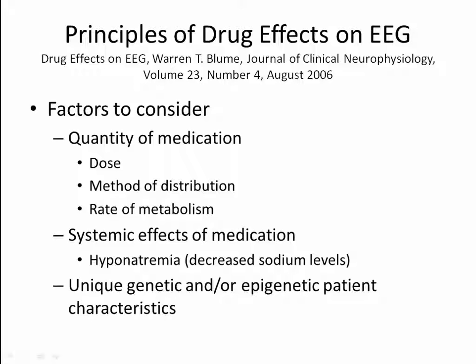And that's fine, but it suggests that the effect that medication has on one person may not be the effect that it has on another person. So coming up with standardized values of the effects of medications on the EEG can be a bit tricky.